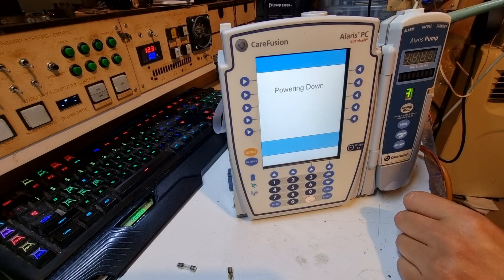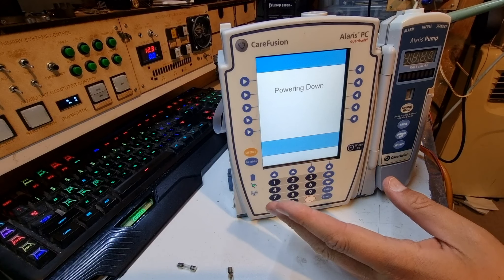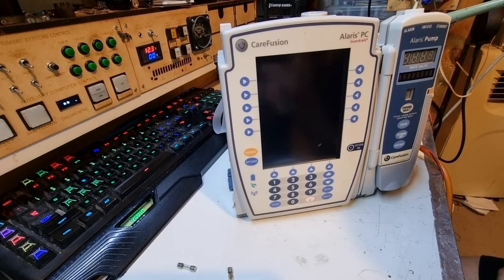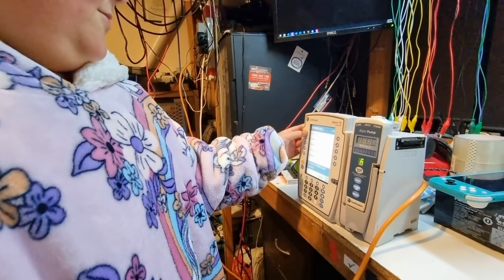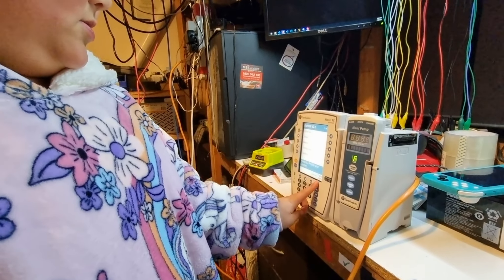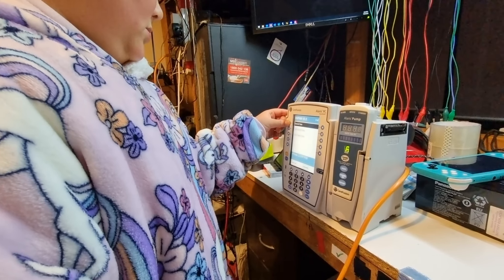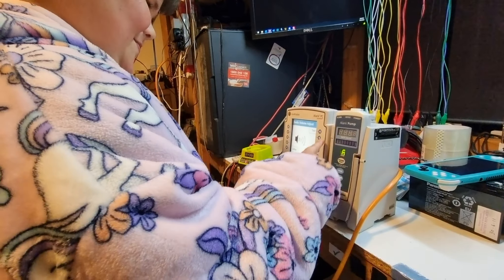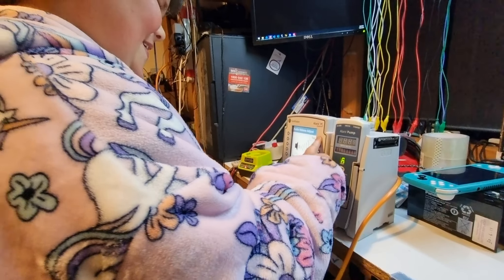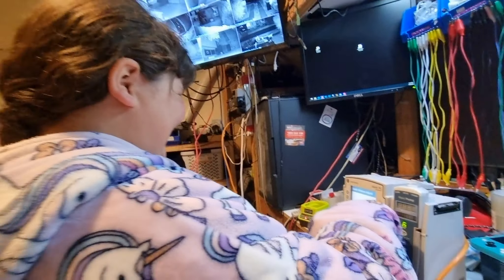So this is going to work — I think a new battery is all this thing needs. The other one has much bigger problems; I'm going to do some homework on that. We're showing what we've learned about it — pick a category, just go general special care, why not special care for the animals. Confirm it down the bottom. Oh please — don't you just love that sound!